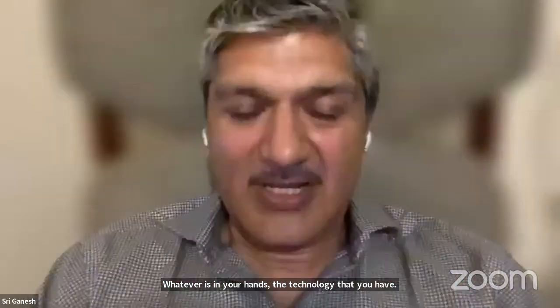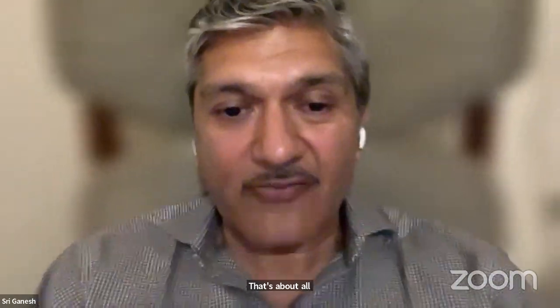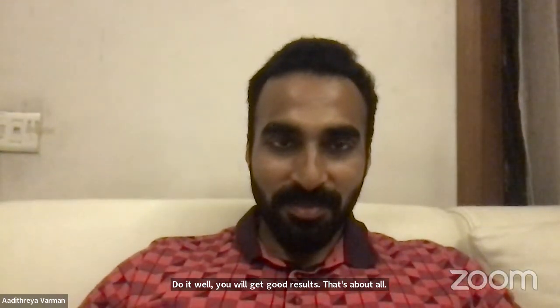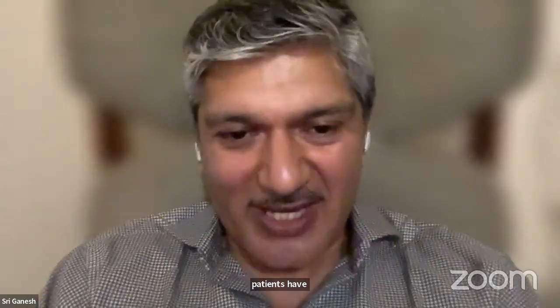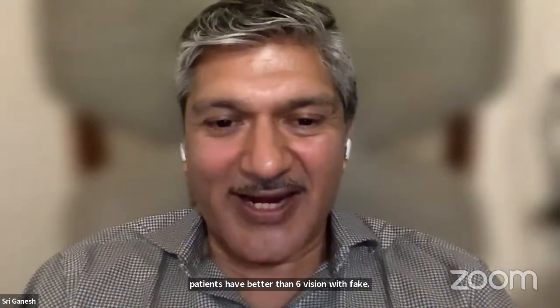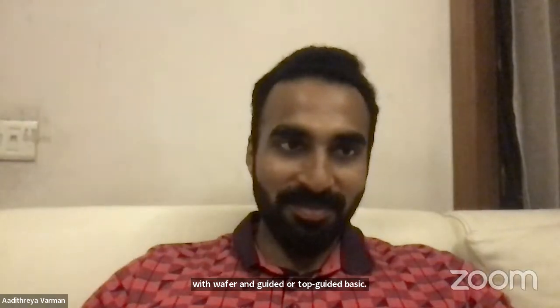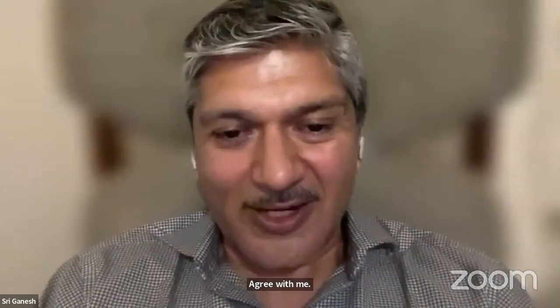Even phakic IOL technology is a non-wavefront technology, and more patients have better than 6/6 vision with phakic IOLs than with wavefront guided or topo guided LASIK. Agree with me? Correct. Yes. So it's a non-wavefront technology.